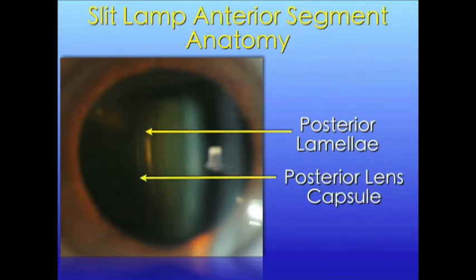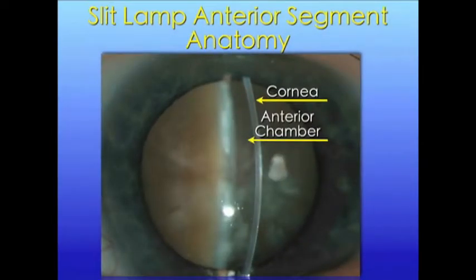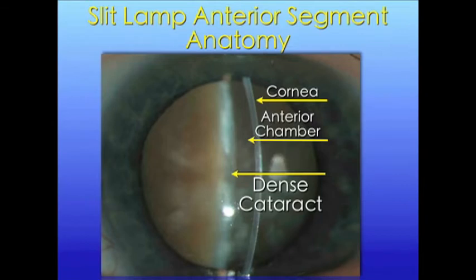Notice, when focused on the posterior parts of the lens, the cornea is out of focus. When a patient has cataracts, which is defined as any opacification of the lens, you will be able to see that. This is an example of a very dense, mature cataract. This is a corneal abrasion. The defect stains green with fluorescein as viewed with the cobalt blue filter.